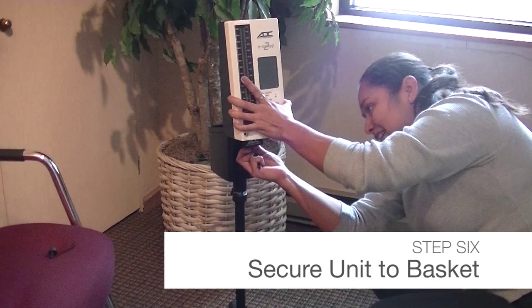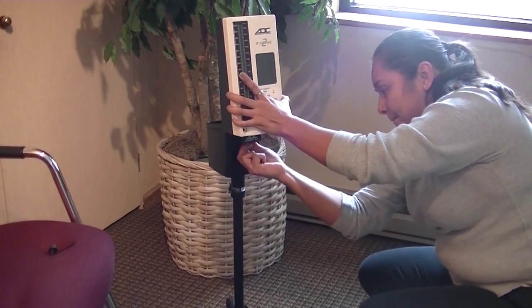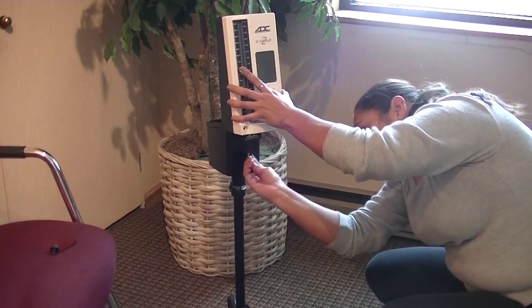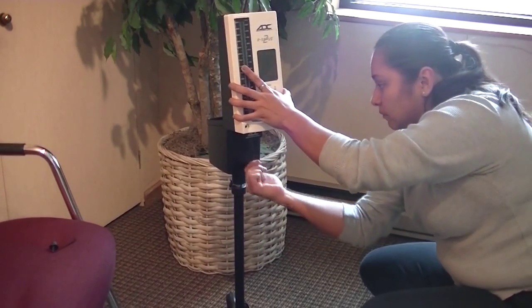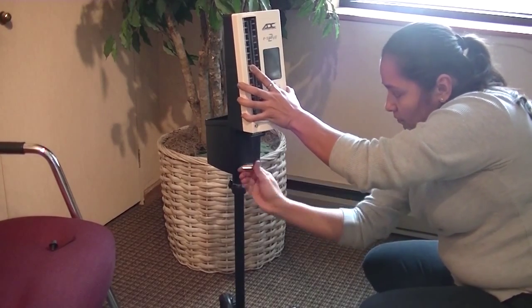Once the stand is fully assembled, you can attach your manometer using the 6mm Allen bolts to secure it in place. Ensure that this connection is tight to avoid damaging your manometer. Attach the inflation system to your manometer and store the cuff and bulb in the attached basket.